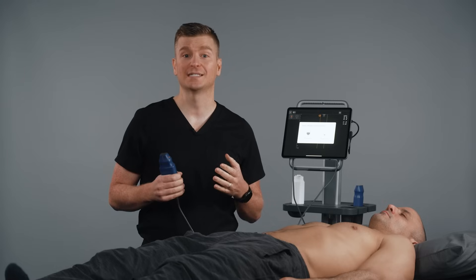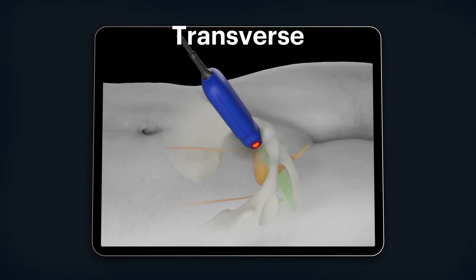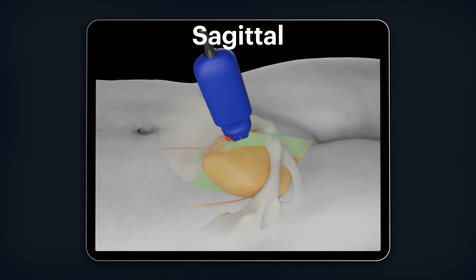For this patient, we're going to select pre-void volume. We will be obtaining two views of the bladder to make the calculation: the transverse and sagittal views. A transverse ultrasound view shows a cross-section of your body, while a sagittal view shows a side view.